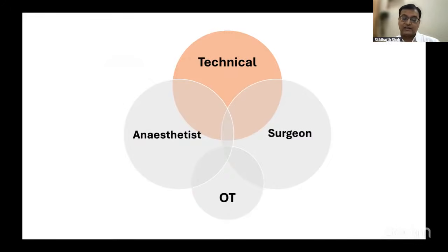The second aspect is, once the screws are in, you would want to check if the screws have a breach or not. For that, there are two schools of thought. I tend to check all my pedicle screws at the end, altogether, but some surgeons tend to do it after each screw is placed. That depends on the surgeon's preference. As long as the MEP is okay after every screw, you hear your neuromonitoring team say that we've got a good response after each screw, your communication channel is smooth, then you move on to the next screw. We finish the left-sided screws, we document the end of instrumentation on the left, we move on, we document end of instrumentation on the right.